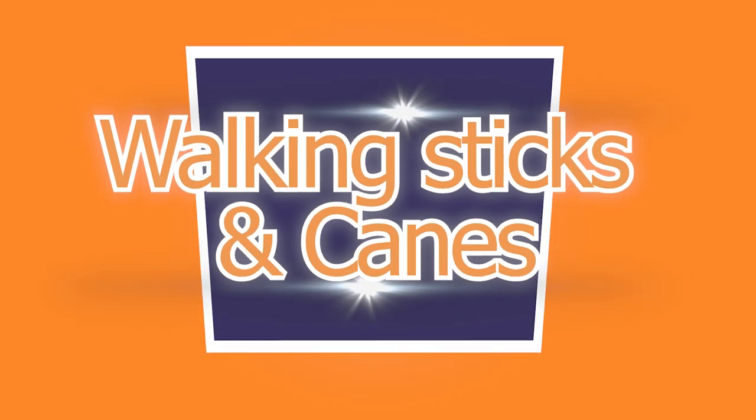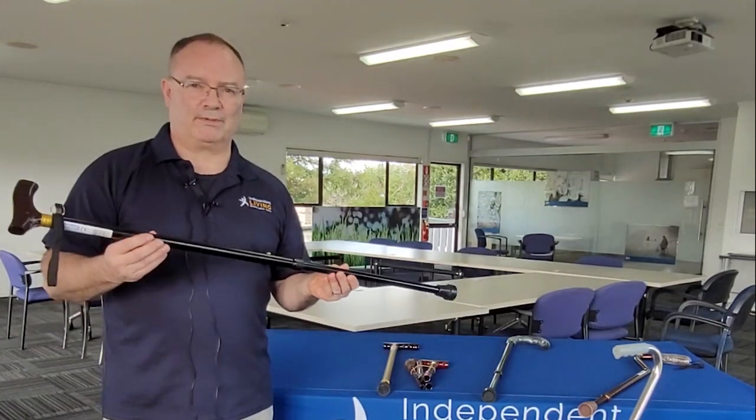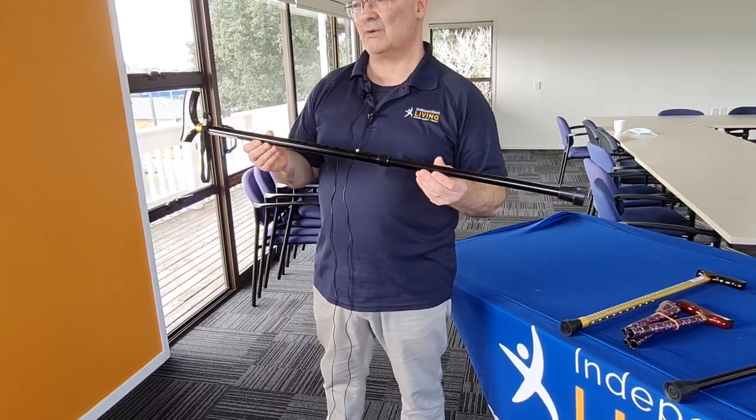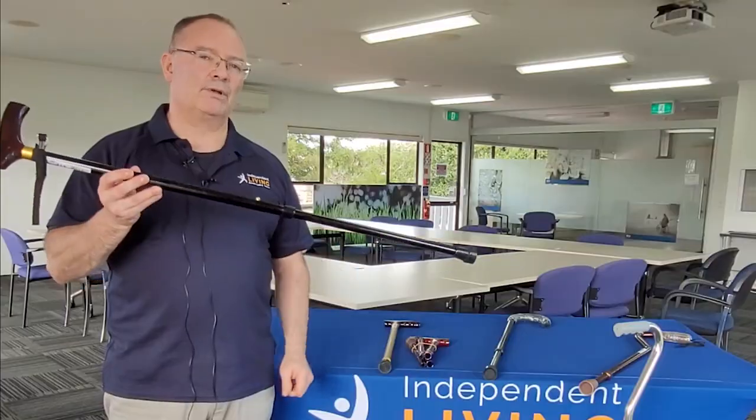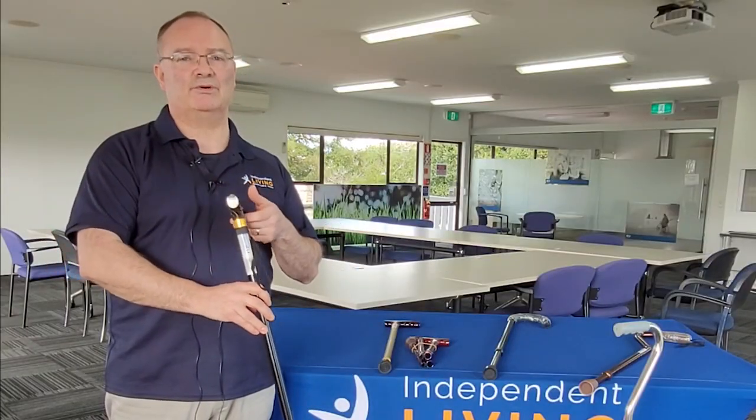So I'm now going to talk a little bit about walking sticks. One of the issues that people have with walking sticks is they just go and get a stick and start walking with it, which seems perfectly logical, but a walking stick needs to be sized to you as the individual.